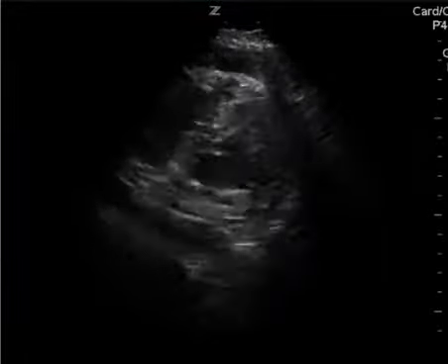So I hope this video helps. To look for a pericardial effusion, really the best view is the sub-xiphoid view. The challenge is if someone's getting CPR or getting bagged, the stomach fills with air, and that makes it challenging to see because you have this pocket of air in the stomach.